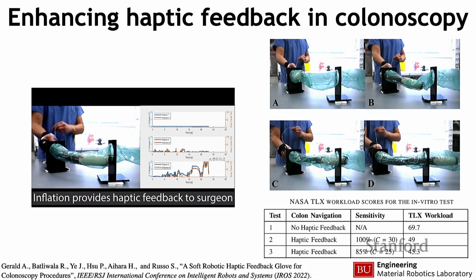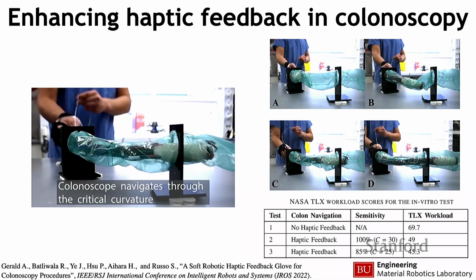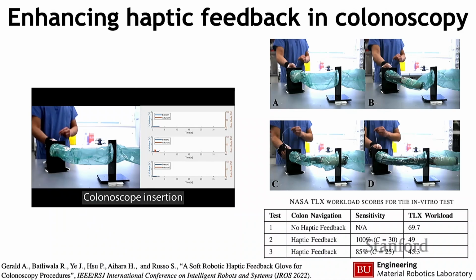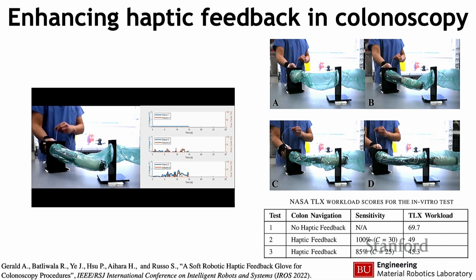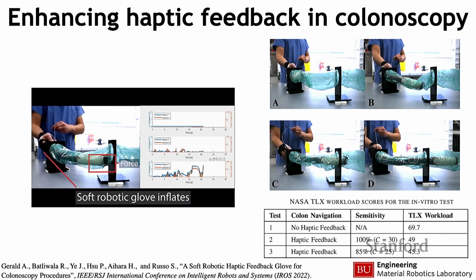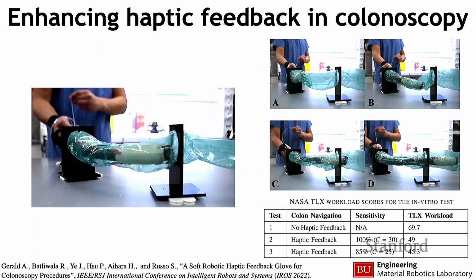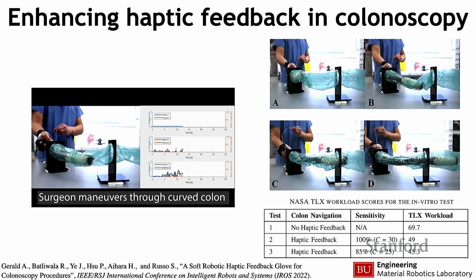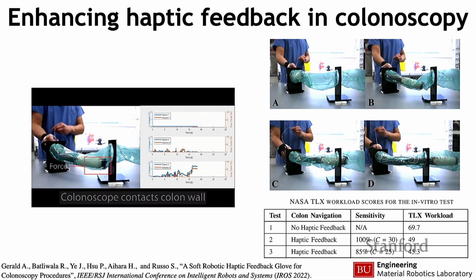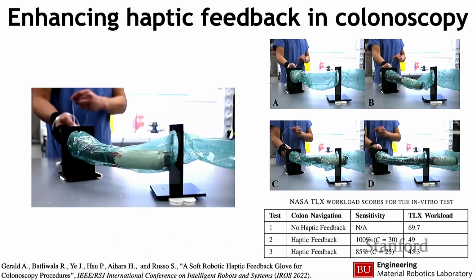And then again, for a more trained person, you would still see an improvement in the procedure. We measured the NASA task load for our surgeon, and we were able to see that the mental and physical workload was diminishing for them as they were performing that procedure. But you can imagine that even if you were taking somebody novice, that would help them be more trained and be able to perform a better procedure in the long run. So these technologies can not only help patients and surgeons as they are performing the procedures, but even help during training.